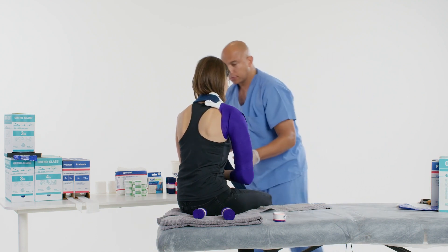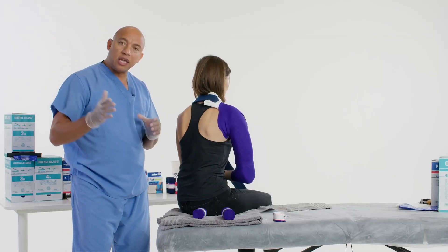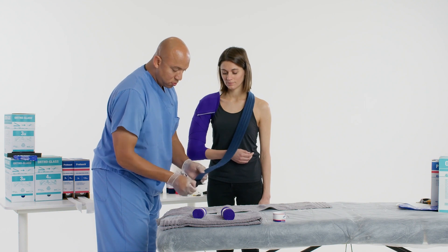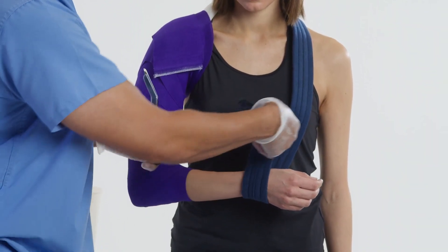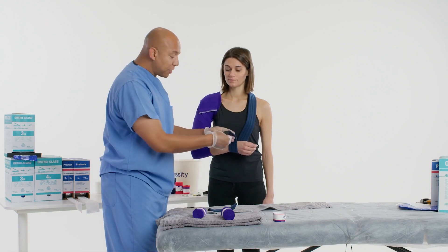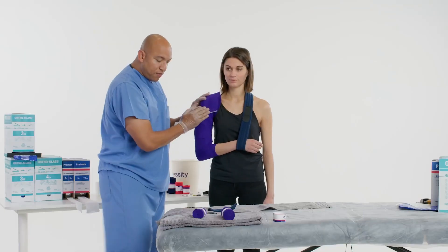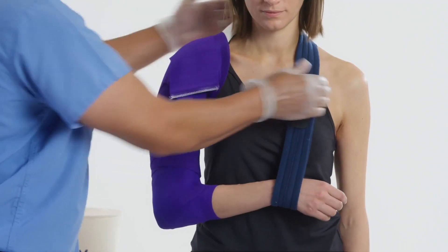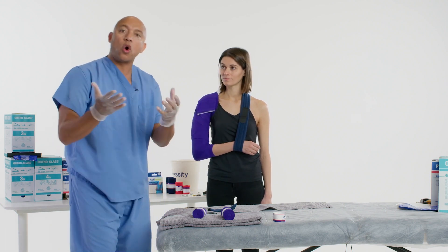Tape that down. Now we're going to turn the patient around so you can see how we attach the sling on the roll. We can do a little modification to shorten it slightly. What's convenient is that the provider can, depending on how the fracture is displaced — anterior, posterior, medial, or lateral — position the patient a lot faster. Secure this portion with tape. Now we can position the patient with ease, and it stays — it counterbalances to keep the splint from pulling down. This is a unique way to apply the sling on the roll with the cooptation splint.